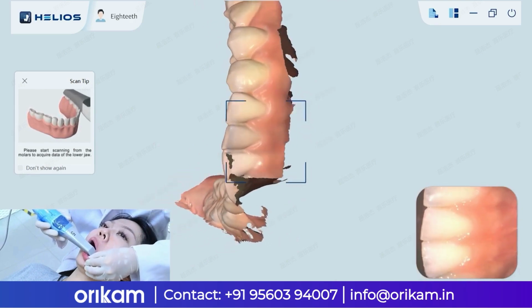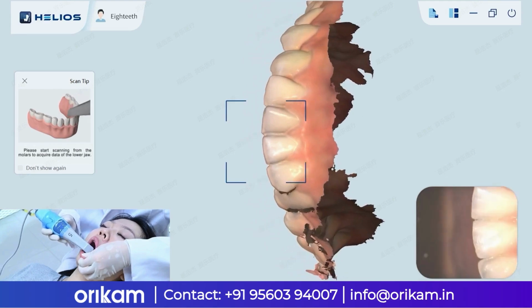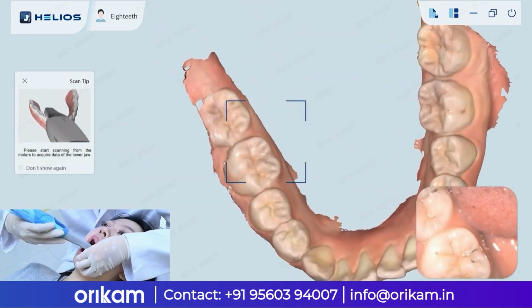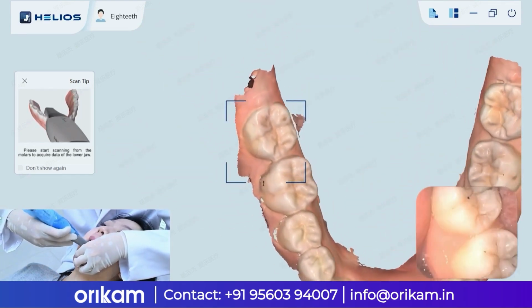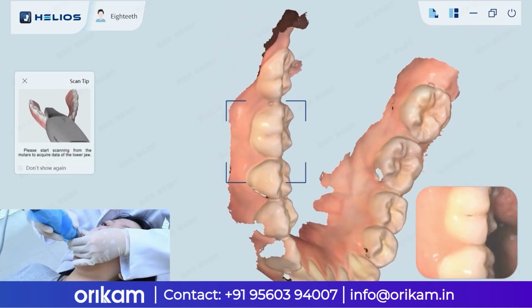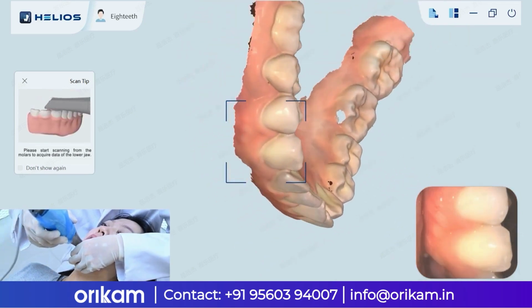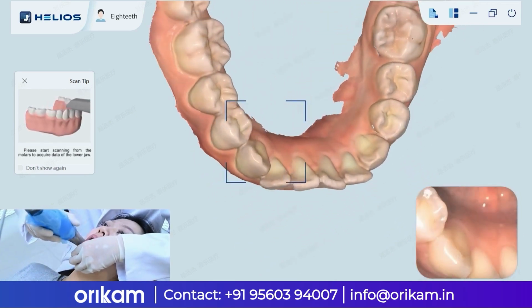When scanning the anterior teeth, you may choose to use your fingers or a mouth mirror to pull down the lower lip while ensuring the patient's mouth is wide open. If wrist mobility is restricted, you can pause to adjust your grip.